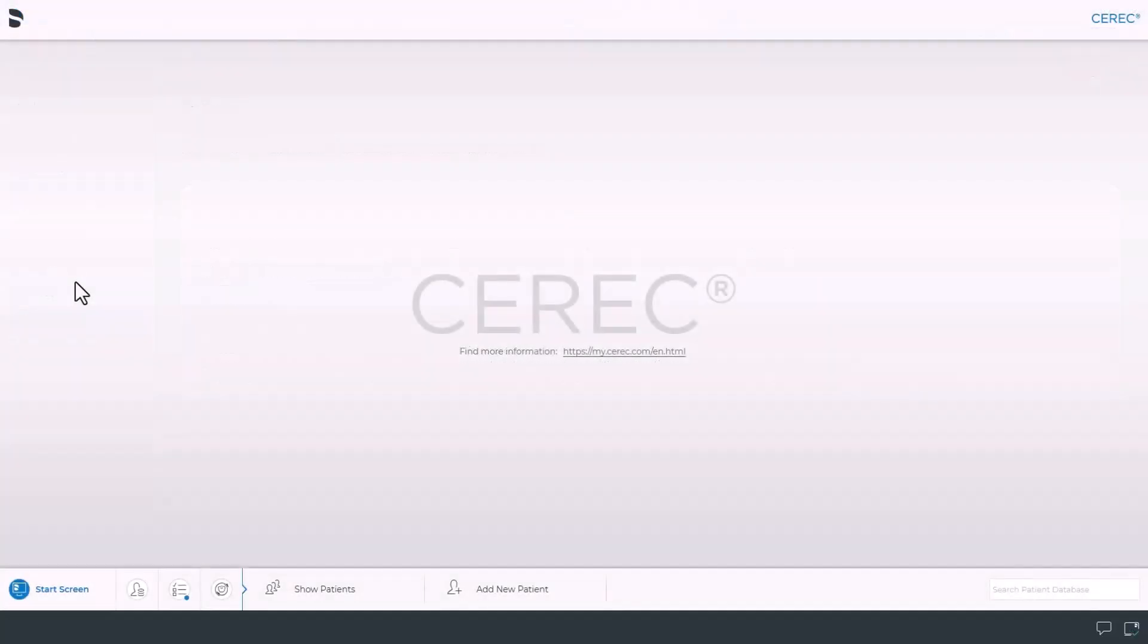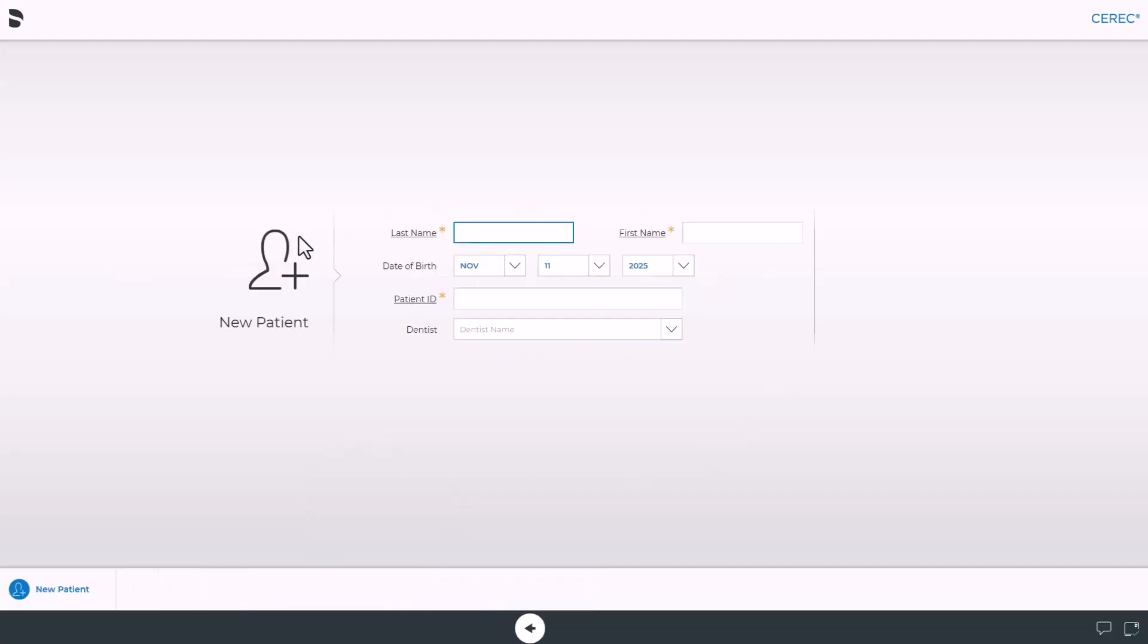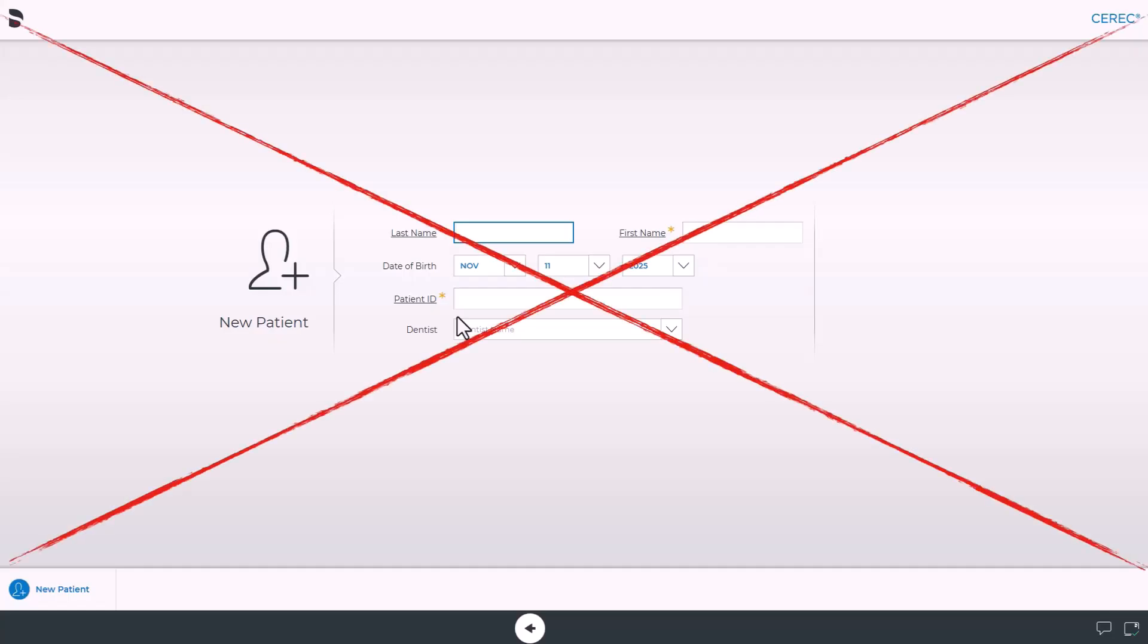Now for years we've been used to creating our new patients in either the CEREC or the Connect software. We'd go ahead and we'd click Add New Patient. We'd enter the last name, first name, date of birth, and sometimes the dentist. This is no longer the workflow we are going to use.